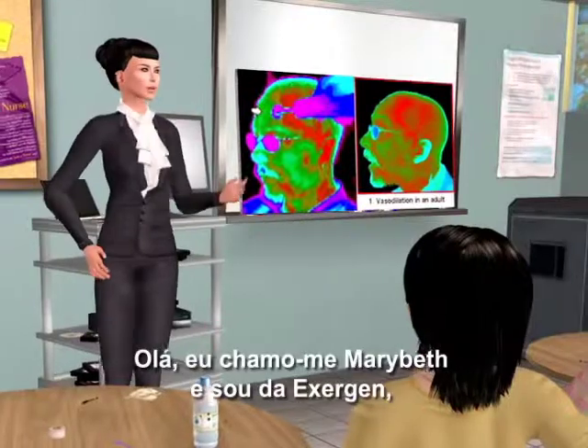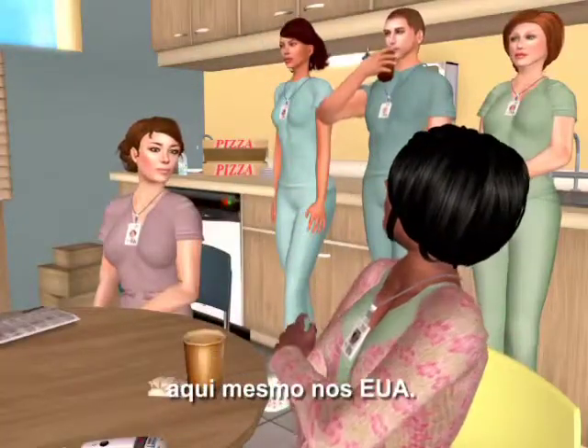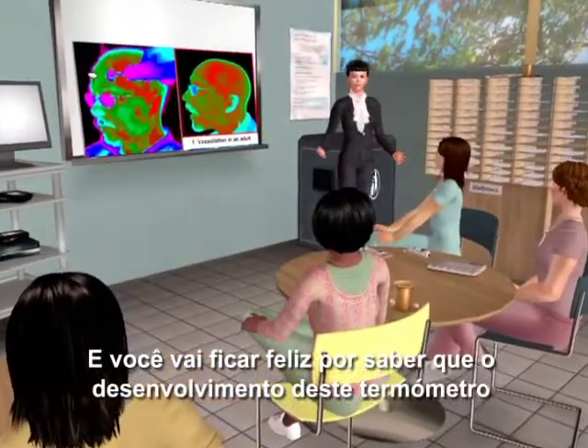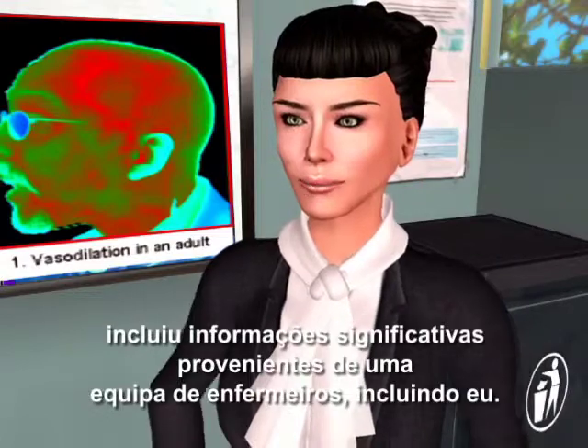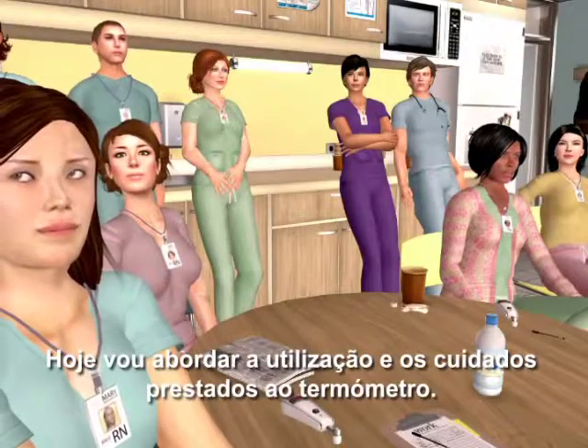Hello, my name is Marybeth, and I'm from Exergen, the company that invented and makes the temporal artery thermometer, right here in the USA. You'll be happy to know that the development of this thermometer included significant input from a team of nurses, including me. I'll be going over the thermometer's use and care today.